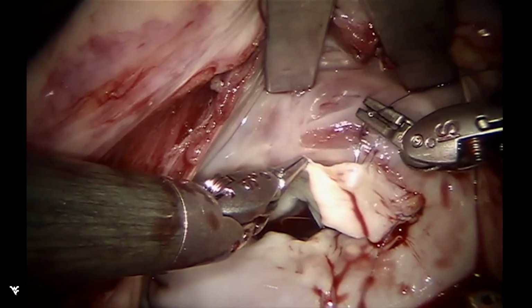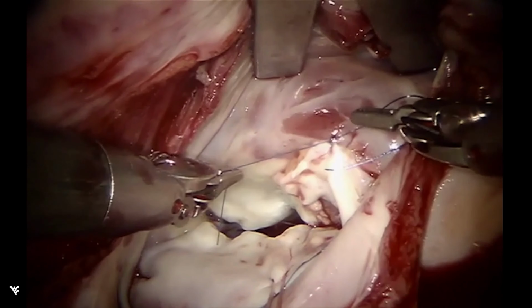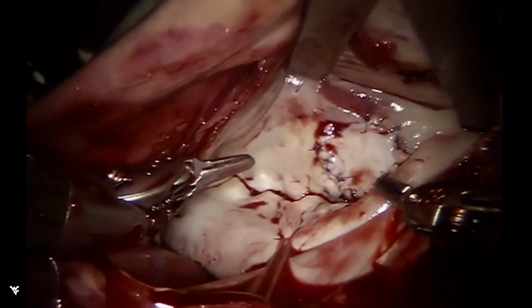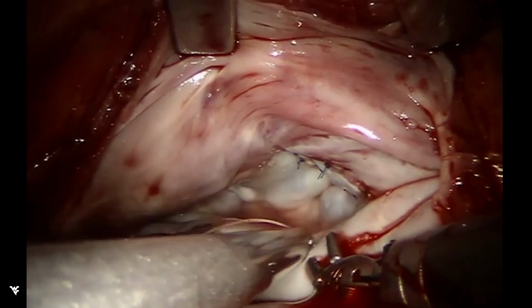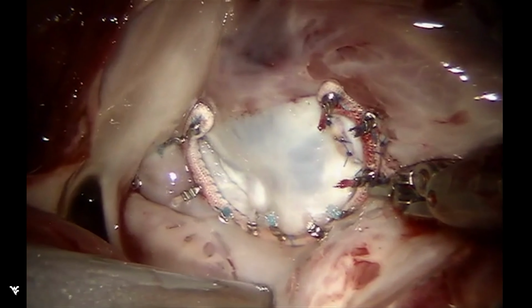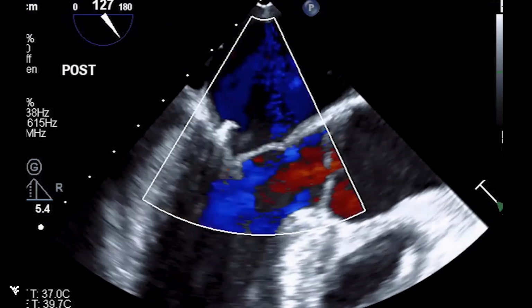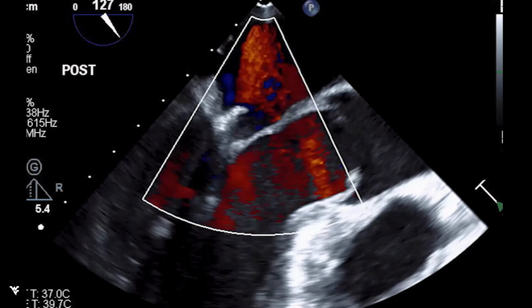This is an onlay patch technique using interrupted fluoromonofilament sutures to create this repair of the defect. This is then followed, after confirming competence, with an annuloplasty band to create a competent valve without stenosis.